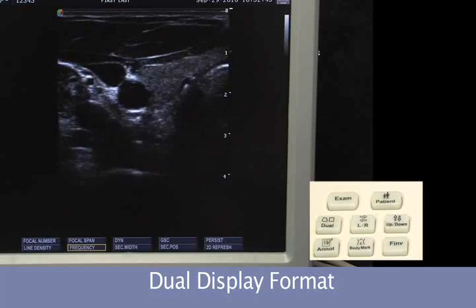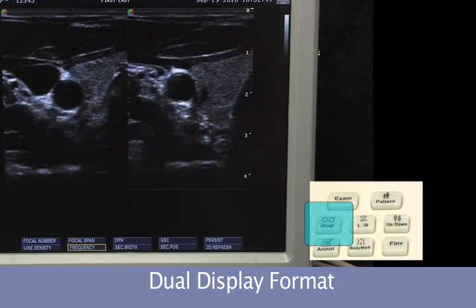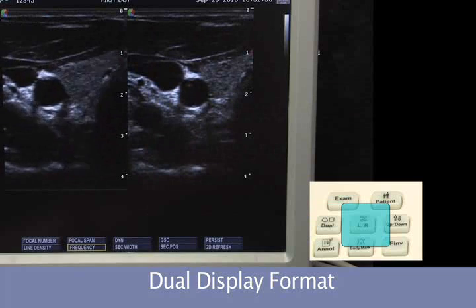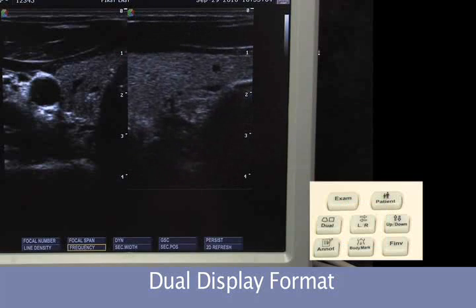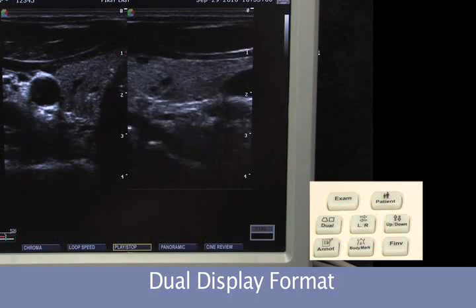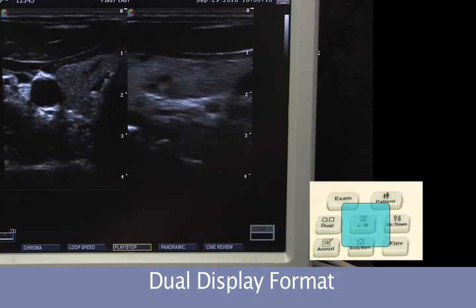System images can be displayed in either a single or a dual format, and we can toggle between left and right using our left-right arrow button — transverse, longitudinal. Freeze. We can cycle back using the left-right arrow key to go to the other one to adjust that position, and save.